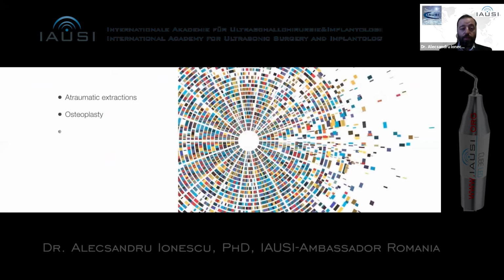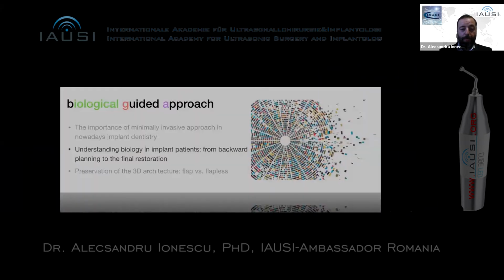Now, we use it for atraumatic extractions. We use it for osteoplasty. We use it a lot for bone splitting. So bone splitting is done, I think, 99% now with piezo surgery, vertical augmentations as well, internal sinus lifting, and also cutting the window for external sinus lifting. And in the last years, we use it for corticotomy in conjunction with our orthodontist.